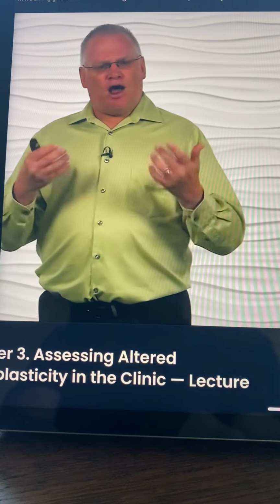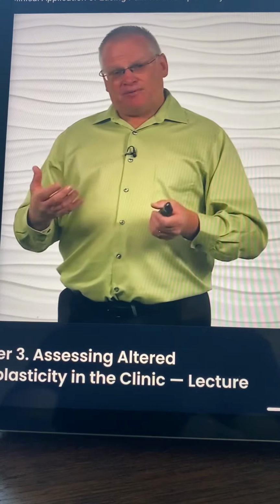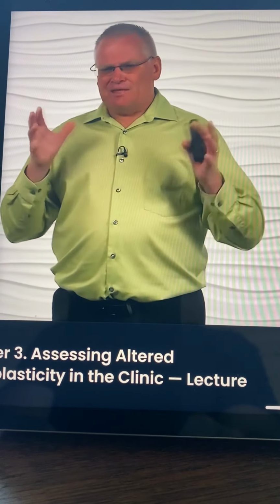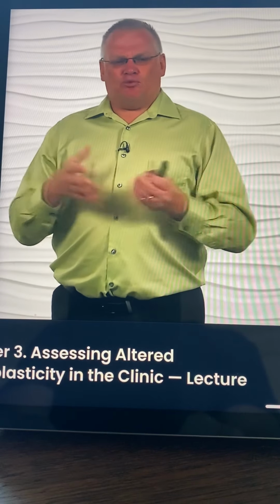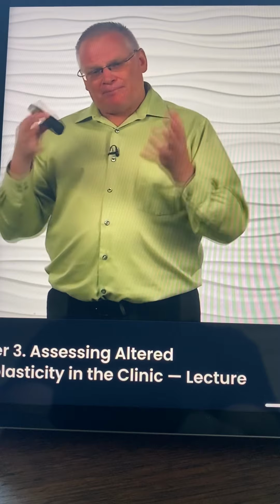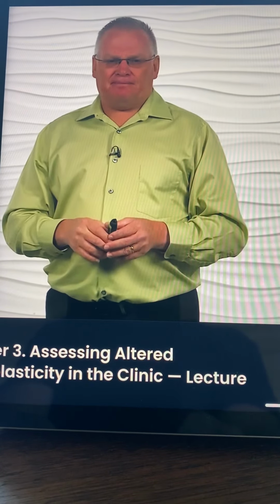Video, I will show you how we use these calipers, for example, on low back. A patient comes in with back pain. Based on how they filled in the body chart, we may have an idea there may be a plasticity issue here. So what do we do? We use a 2-point discriminator to measure for the mapping sharpness in this patient with low back pain.